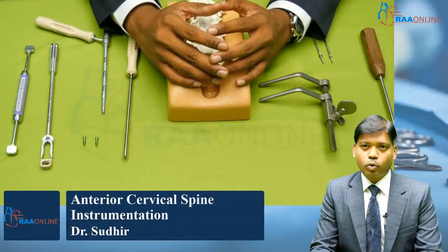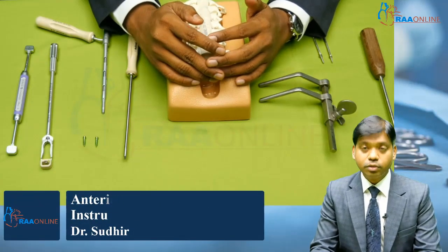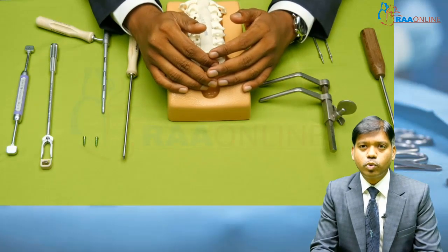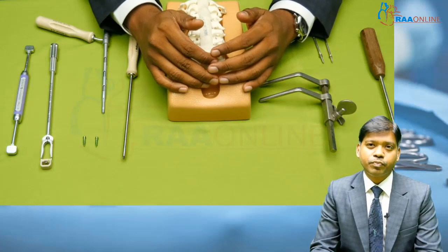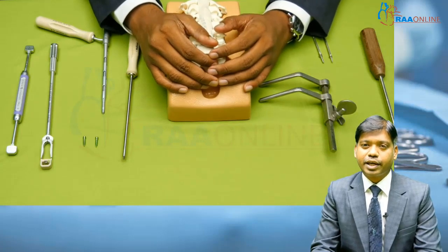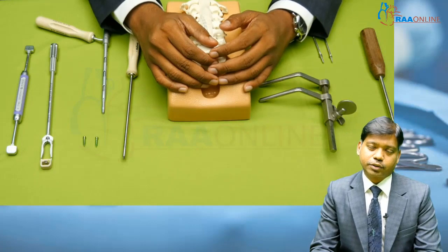Hello everybody. Now in this module we will be looking at cervical spine instrumentation, specifically anterior cervical spine instrumentation. So when do we do anterior cervical spine instrumentation? We have been discussing this in the cervical spine module. We do anterior cervical spine instrumentation in case of cervical disc prolapse or cervical fracture, spine fractures.